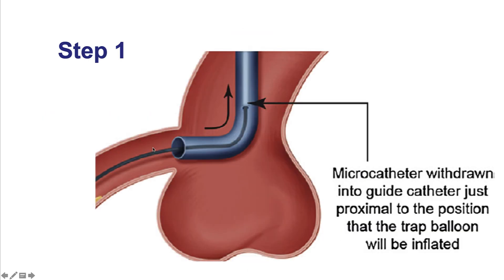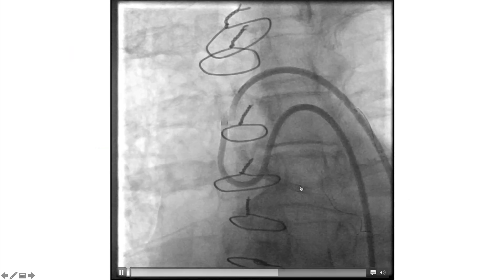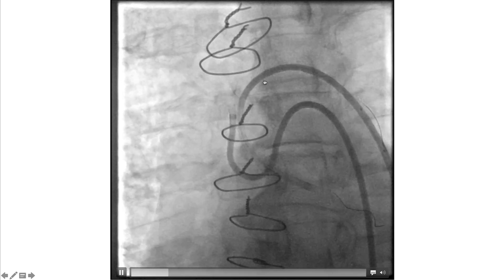The first step is to withdraw the microcatheter inside the guide catheter — typically we pull it back as far as possible. This is how it looks on fluoroscopy: the microcatheter is removed back into the guide catheter.